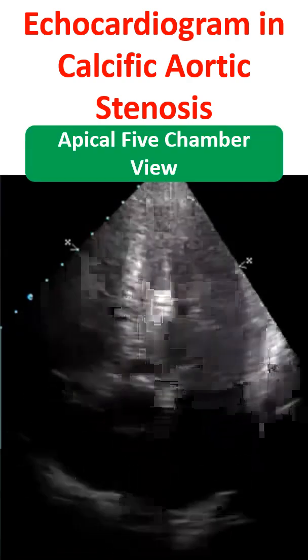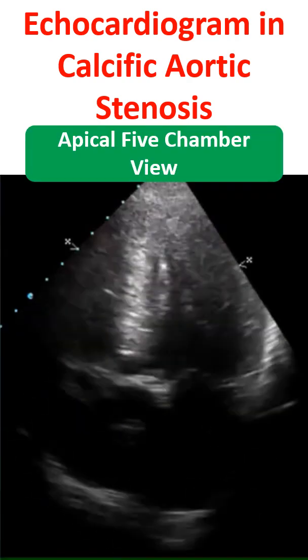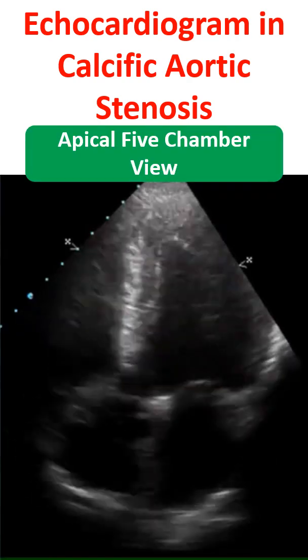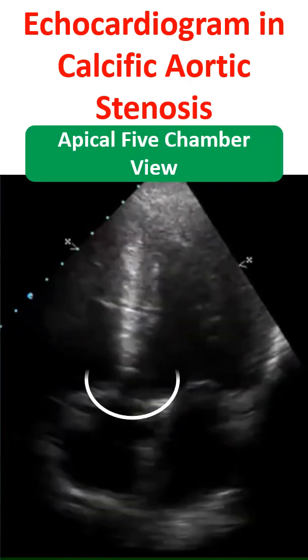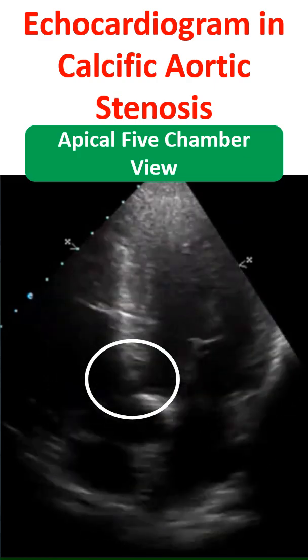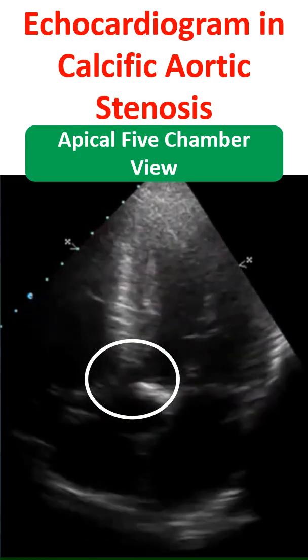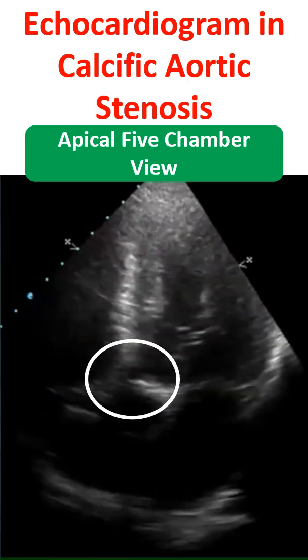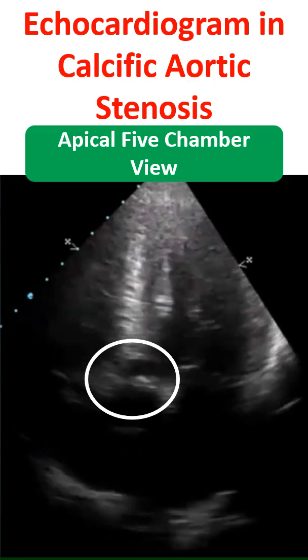Apical 5-chamber view showing the thickened aortic valve. This is the usual view used for estimating trans-valvular gradients as the Doppler beam is parallel to the jet in this view.